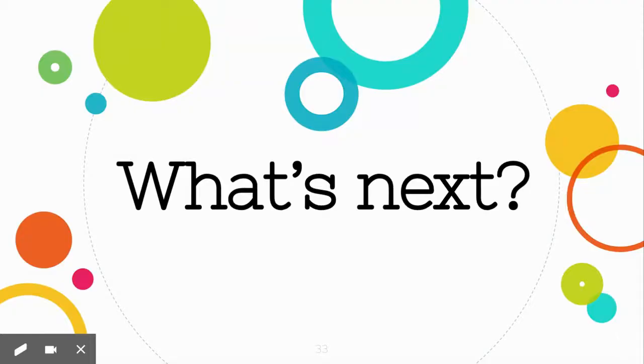I'm sure after all of this information, you have some questions. So please come to your follow-up training with any questions you have, ideas of 2 to 3 words you might like to program into the device so we can walk through that together, and then an idea for an activity at home where you'd like to begin modeling. We'll brainstorm what words you might use and how you might get started doing that.